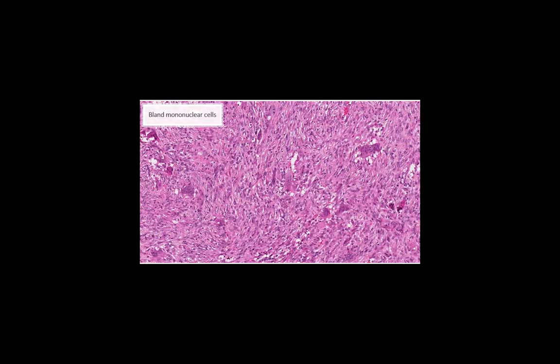Okay, so the histology for non-ossifying fibroma is what you see here. Again, unevenly spaced giant cells, and the background cells are ovoid to spindled, again, no cytologic atypia. And they're arranged in a storiform pattern, which I find is somewhat unique to non-ossifying fibroma. Again, it's always important to look at the mononuclear cells. Here they look very bland, no real hyperchromasia or cytologic atypia. Again, you can see mitotic figures. That doesn't bother me as long as I don't see atypical mitoses.